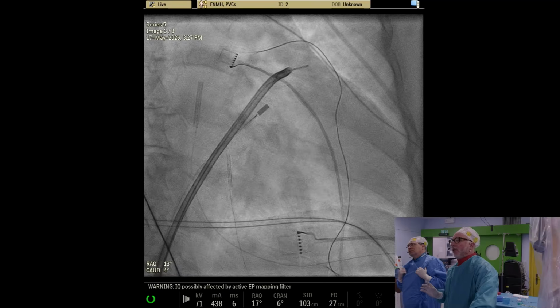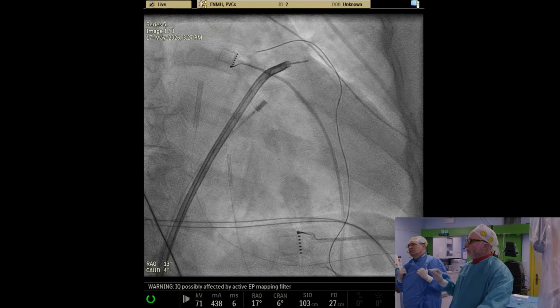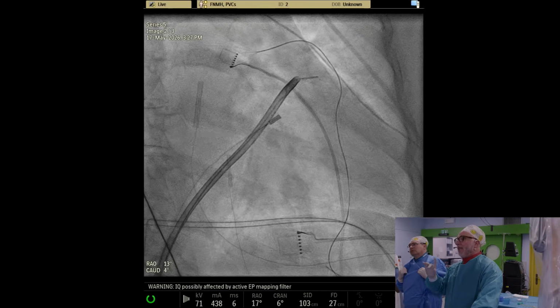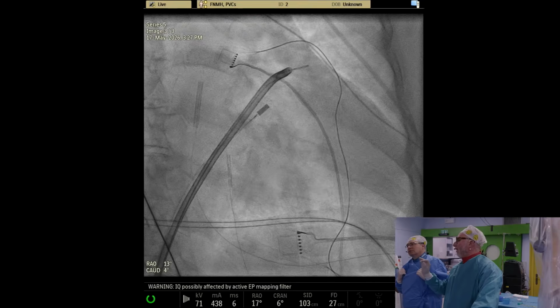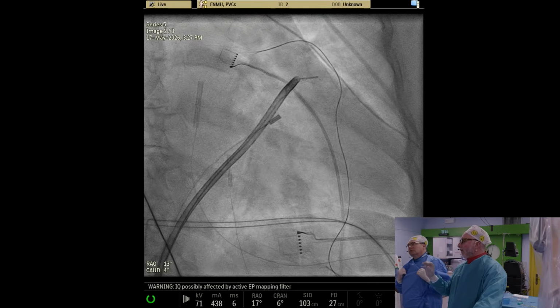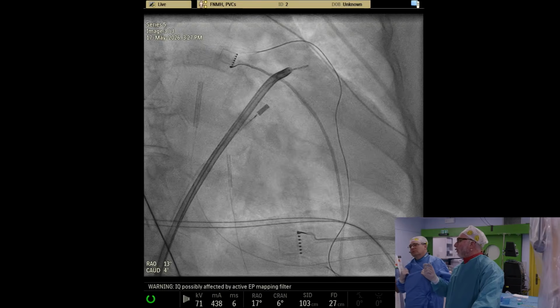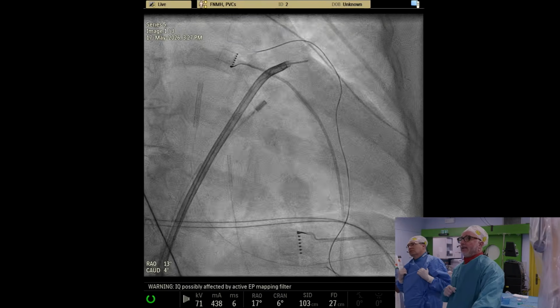Okay, you see this. Because the curve is kind of straightforward, you can keep support in the AIV. In this case, we're just using the wire and then the Agilos itself. You slowly advance and you wait, and you let the heart itself kind of integrate the Agilos into the venous circulation. You don't push. You play with counterclock up and down until that catheter gets there.